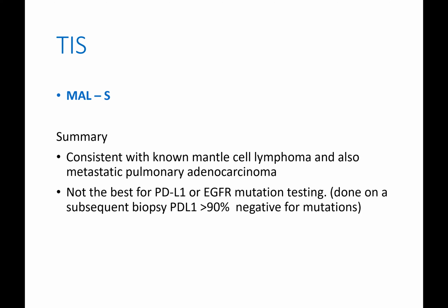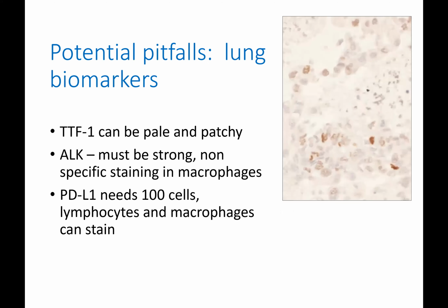It is worth noting that this kind of sample with a large number of background lymphocytes and only a few epithelial tumour cells is not best suited for PD-L1 or EGFR mutation testing.